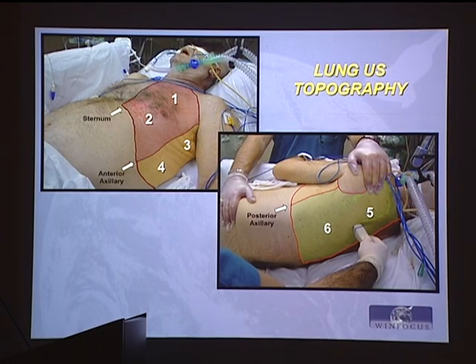Is that clear? So the number of windows and the position of the probe will depend on what I'm looking for. But essentially I try to highlight to you at least 3 approaches. One extremely emergent, the quickest and the most independent one. Then 6 windows for most of the causes of dyspnea or hypoxia. Then when you're looking for a very focused and localized lesion, you just have to check thoroughly the surface of the lung, and you have time to do this, because it's another kind of setting.